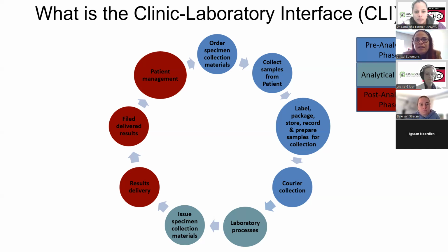And when we refer to EGK, it's basically clinicians requesting bloods out of guidelines or not applying the EGK codes, etc. So there are various factors, and I think Irshan, my colleague, will also present on the actual rejections that we do get. But I just want to highlight here that it's mostly in the pre-analytical phase in terms of how the sample is collected, and then you will see how the post-analytical phase can also contribute to errors.